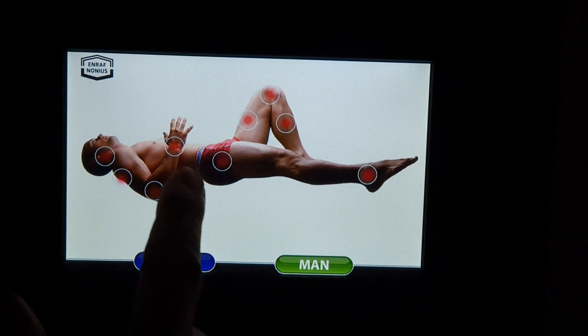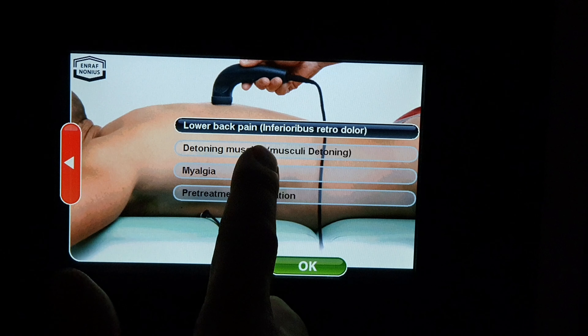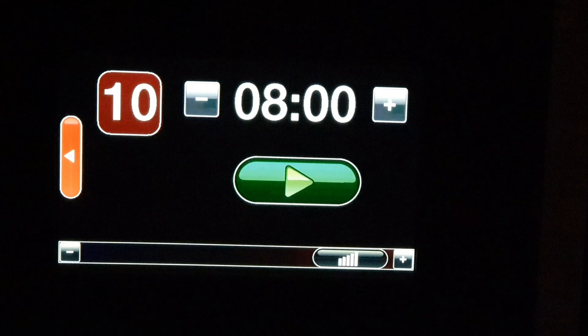Today I'm going to be treating the back using the Enrafnonius Tecar Pulse. We'll come into the back and choose Detoning Muscles. You'll see it's pre-loaded the temperature at level 10 and we're going for 8 minutes. I like to do 1 minute per treatment head size. This is a fairly standard protocol for the back, so we'll see this now from the patient's perspective.